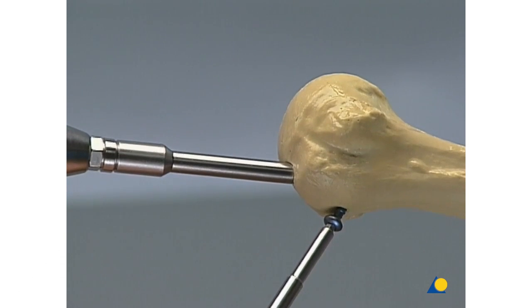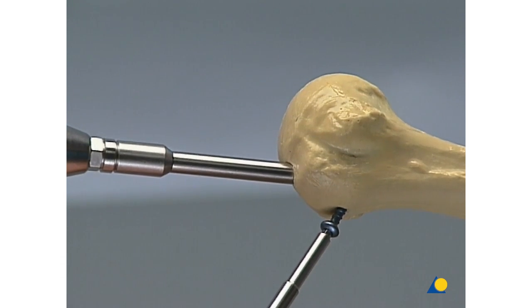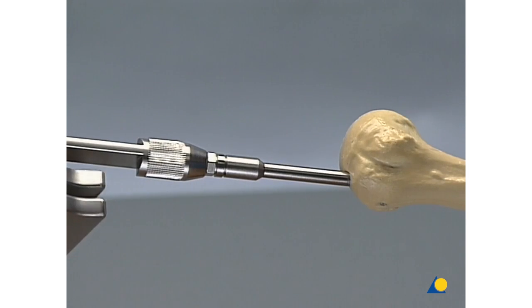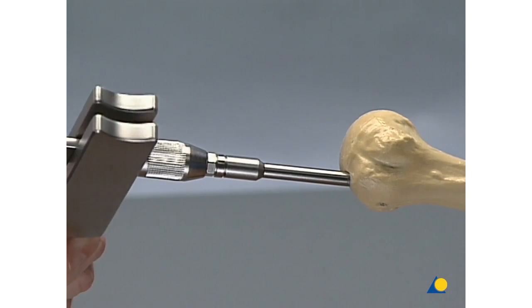First, remove the distal and proximal locking bolts. Then extract the nail using the slotted hammer.